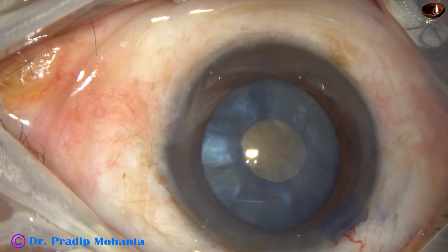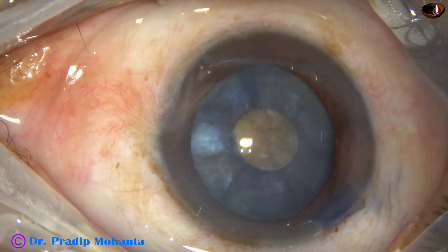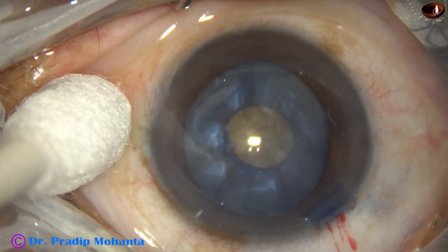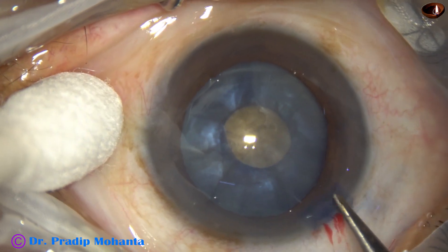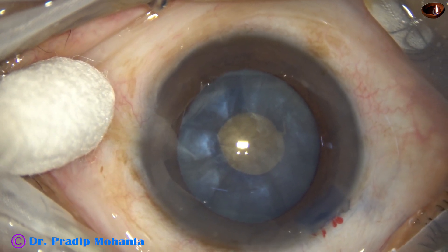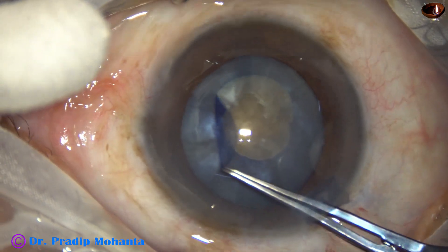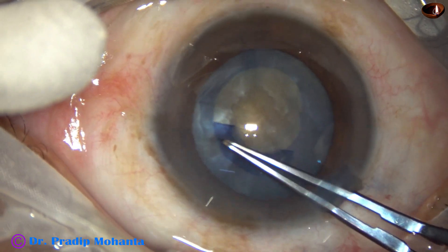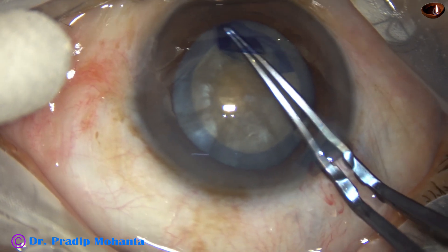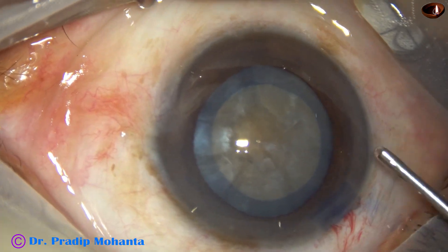If we make the anterior surface flat — if it is not convex — the chance of rhexis runout reduces drastically. Now I take the Utrata forceps at the margin of the mini rhexis. The anterior chamber has been filled with viscoelastic, using the Utrata again to enlarge the rhexis and do an optimum-sized rhexis. The size of this enlarged rhexis is about 5.25 or 5.5 millimeters.